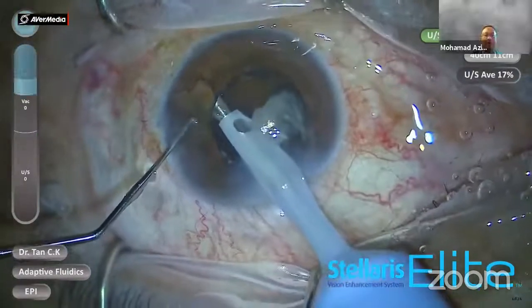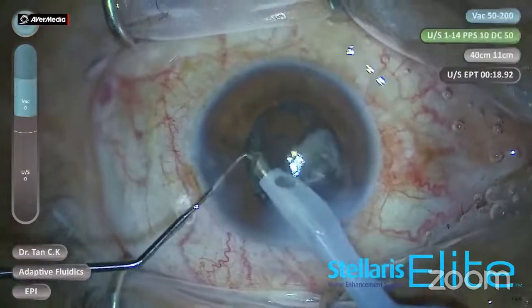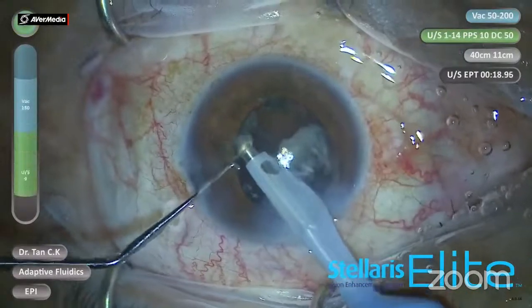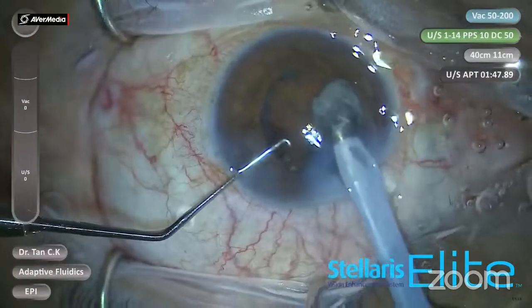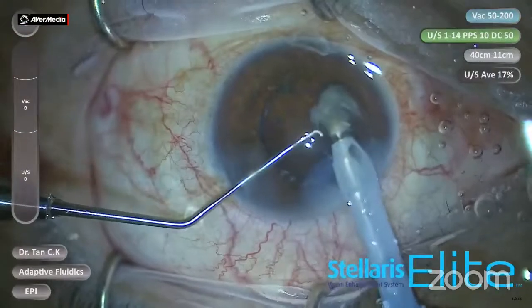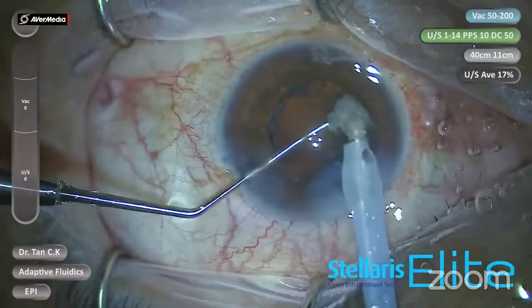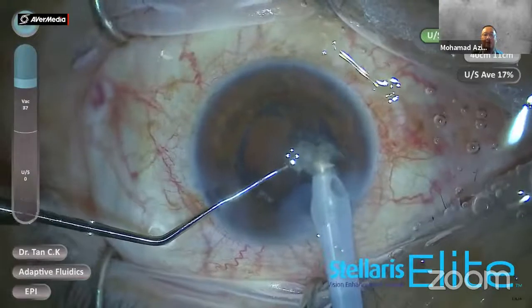So what did I tell you? You have to go direct to the segment. Yes, we have to go direct. So basically maintain the probe at the center and then rotate and also bring the remaining nucleus by using the second instrument towards the probe, so that we don't aspirate any viscoelastic instead of the nucleus. You shouldn't aspirate your tamponade.